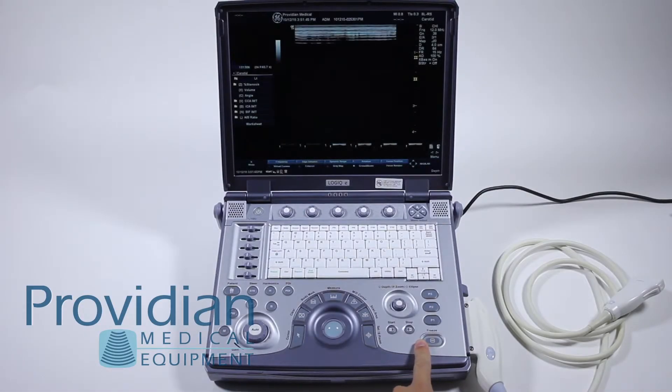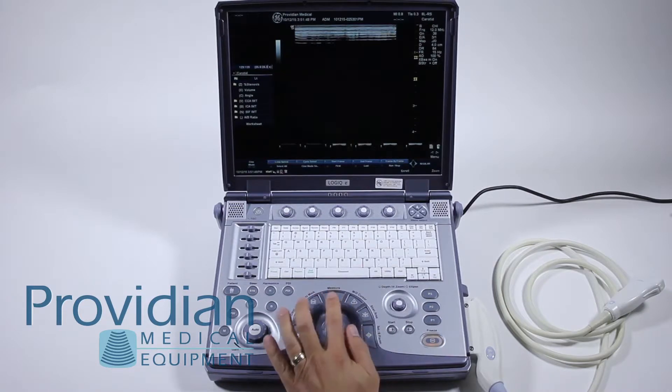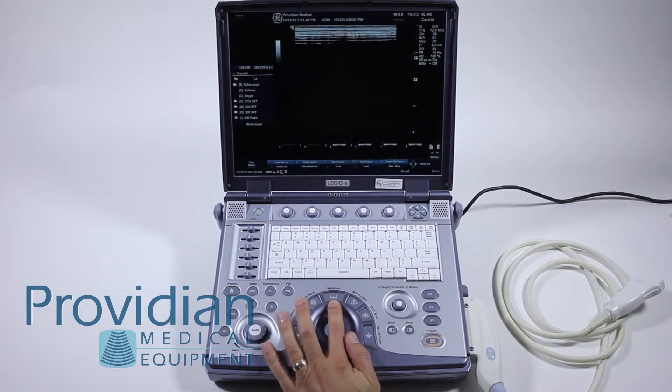To make measurements on the GE Logic E, press the freeze key. The next step will be to press the measure key. Measure does both standard distance and basic measurements as well as calculations.